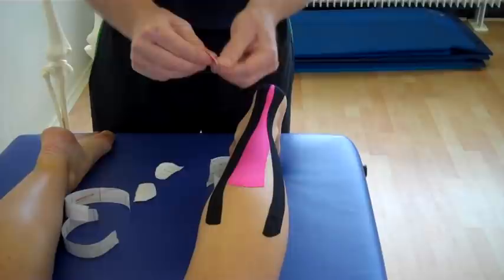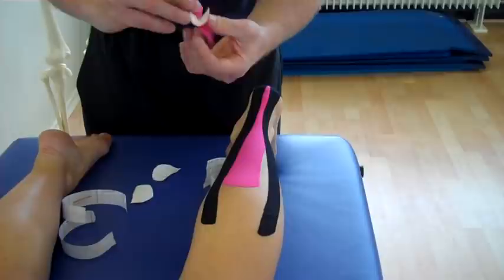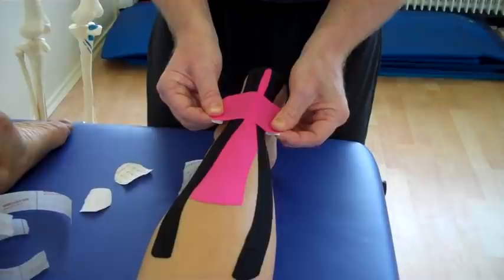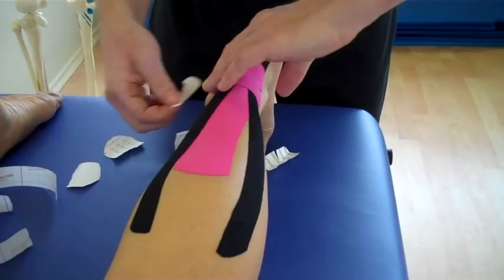The last bit, which is an X-strip, is split in the center. Peel back both sides, and what we're going to do this time is keep the corners. Maximum stretch on the center — think about where the X was located. Maximum stretch, apply over the area. And then the lugs, literally with no stretch, just feed out.